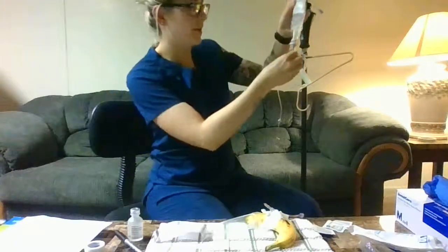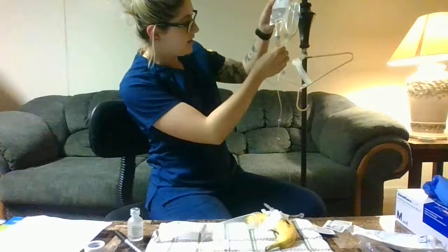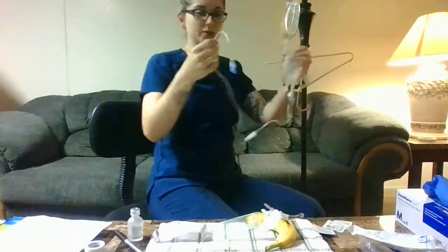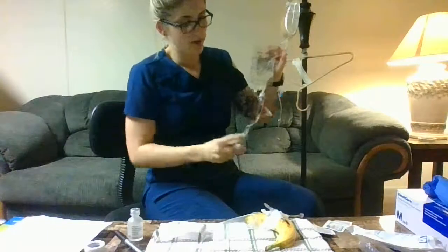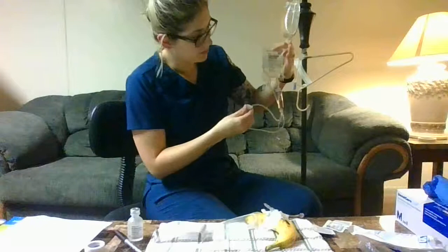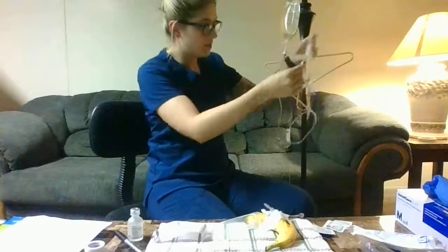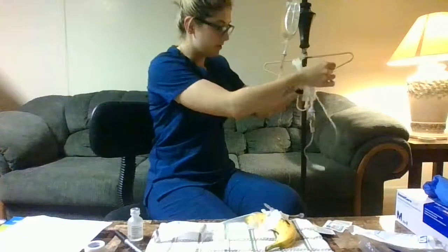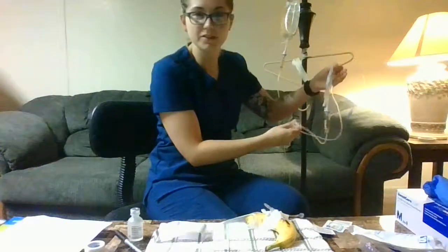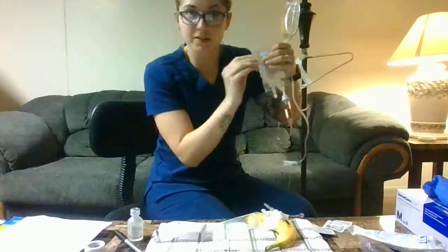Got to push that out of the way. Okay. Then you're going to squeeze your chamber and fill it up halfway. And then just like before, you're going to prime your tubing by unclamping it and letting it go through the end. And you don't want it to drip out a lot because then you're losing your medication. So make sure you're really watching that and not a lot of this drips out.